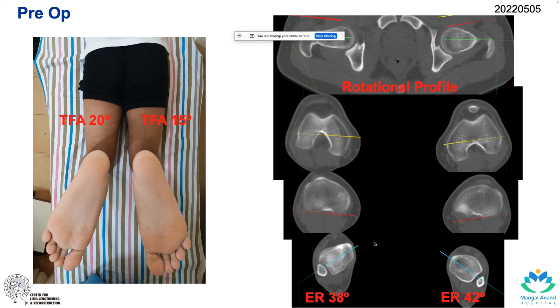We also perform a CT rotational profile to measure the exact deformity. Version in the femur is fine — all the external rotation deformity is in the tibia. On the right side it is 38 degrees of external rotation, and on the left side it is 42 degrees. Since up to 20 degrees is normal, that gives approximately 18 and 22 degrees of deformity respectively.